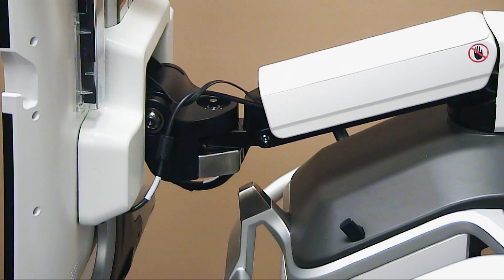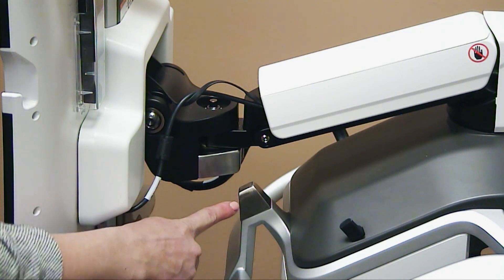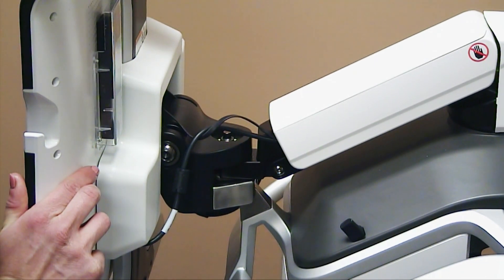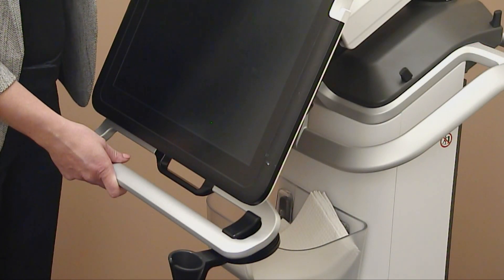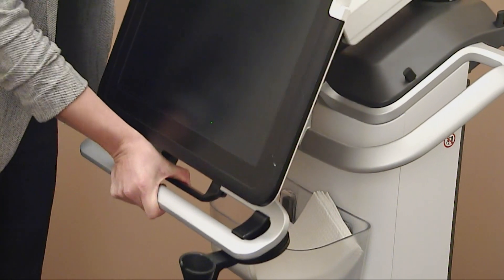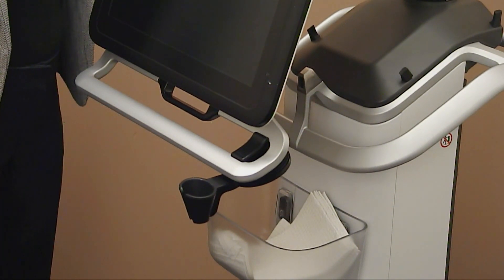To lock your monitor, align your locking mechanism and push until you hear a click. Now it is locked. To unlock your monitor, squeeze your black handle and release. Now your monitor is unlocked.